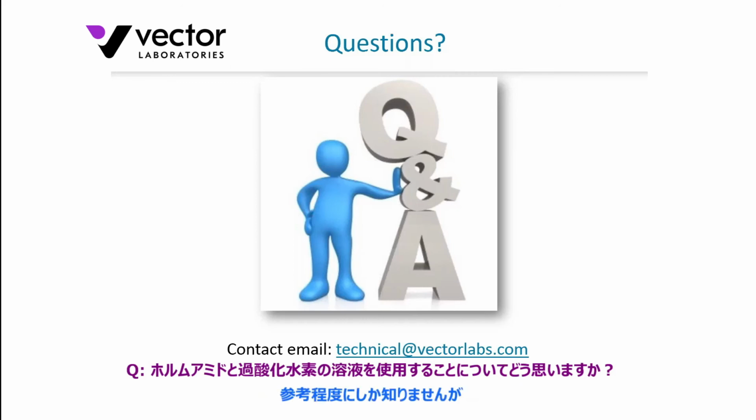In one of the methodologies that I highlighted in terms of references, I have used something that uses glucose oxidase, glucose and sodium azide. It is a very gentle approach, and you can let the tissue wallow in that for a period of time, and it is very effective and more gentle, I would say, than potentially what was described there in terms of the methodology. So I think there might be other alternatives out there.